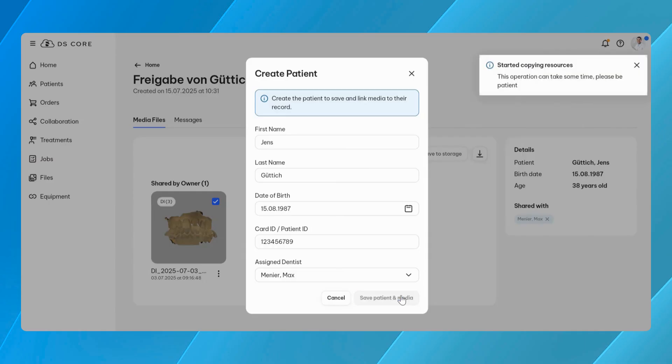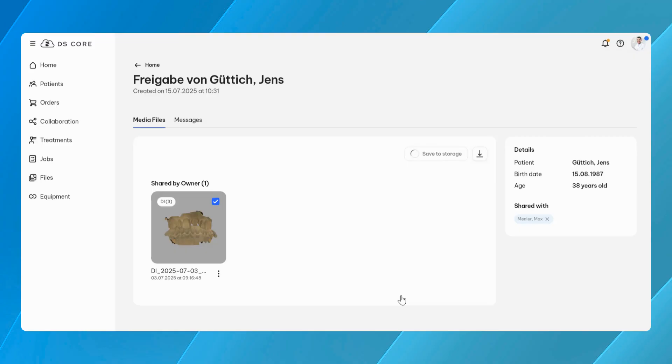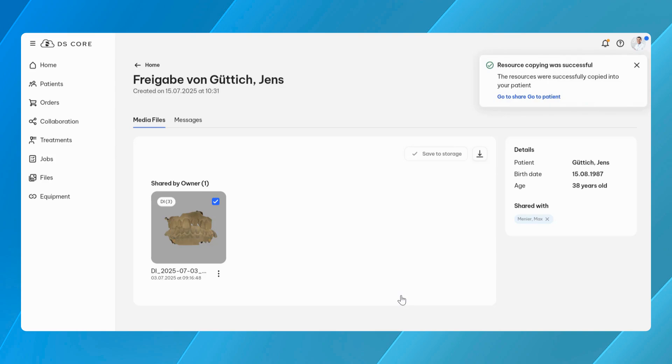For the recipient, shared media files can be saved directly into their own DS-Core account. If the patient already exists, the files are added to the existing gallery. If not, a new patient record can be created, or the data can be stored as an anonymous patient if no identifying information is included and exists on the recipient's end.